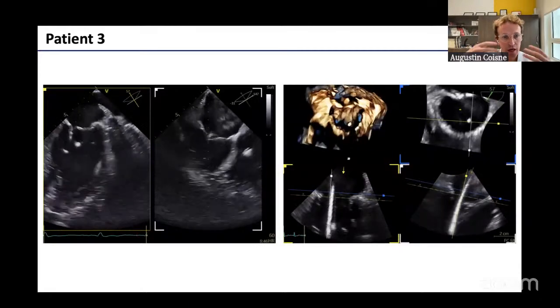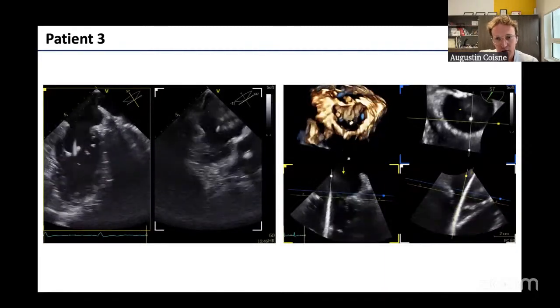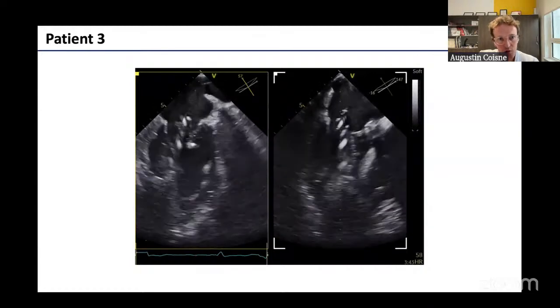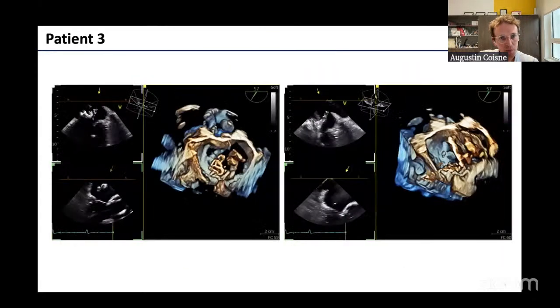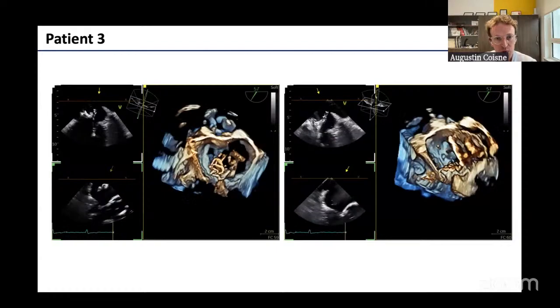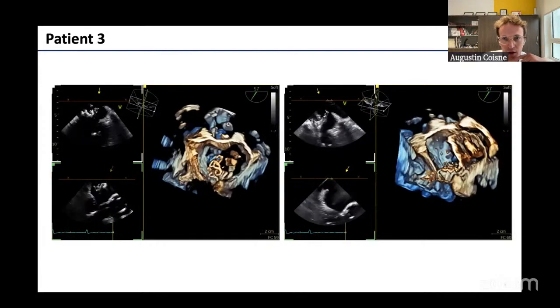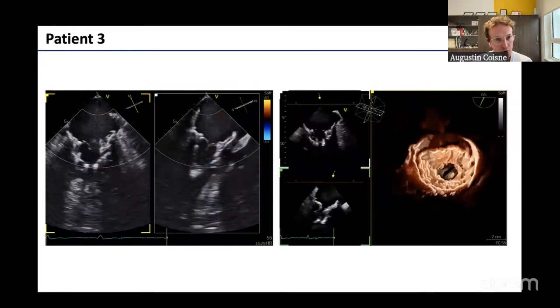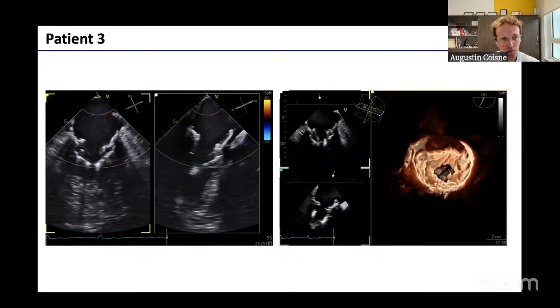And then we put a guide through the mitral valve toward the left atrium. Of course, we can use MPR to be perfectly aligned. And then we progressively advance the catheter, let's say between 1 and 2 centimeters, beyond the plane of the annulus into the left atrium. And then we started to deploy the valve progressively. As I mentioned, it's a valve with a D shape, so we have to put this blind part of the D in front of the aortic valve, which is the anterior part of the valve. In the end, we were able to deploy the valve with very good results, no residual MR, no stenosis, and very good deployment of the device.